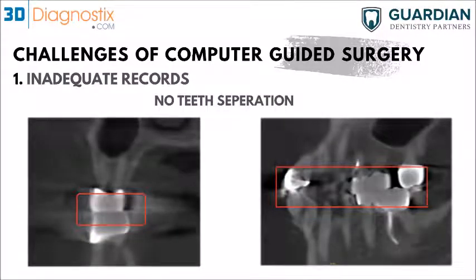One more thing also is teeth separation. We've mentioned earlier that it's recommended to have the patient bite on cotton rolls. The reason is that if the patient has crowns on the top and the bottom, having those teeth in central occlusion would just generate more artifacts, as you can see on the left-hand side. Even if the patient does not have any crowns, it would make it really difficult to separate the arches in a 3D image and check that occlusal anatomy of the dentition, and of course, accordingly, not being able to match the patient's intraoral scan to the CBCT scan.